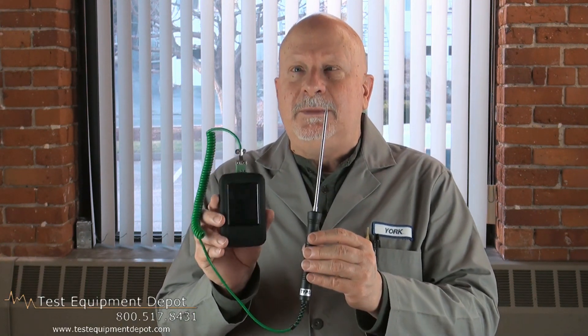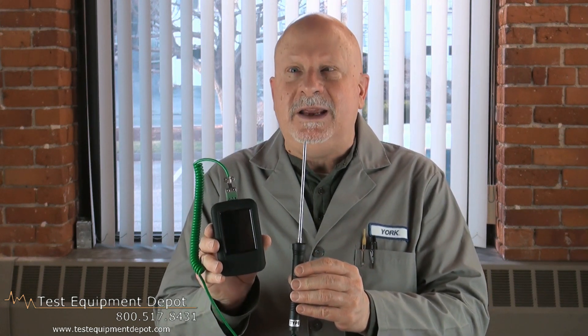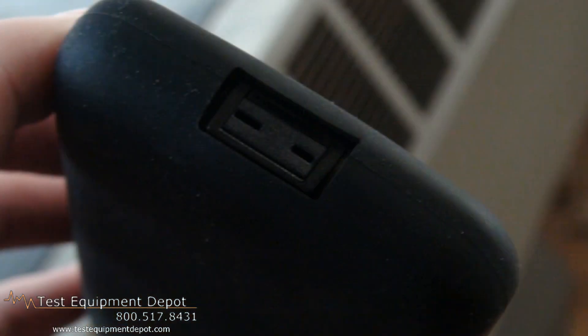Hi, everyone. I am York, the Service Department Manager here at Test Equipment Depot, and I'm going to introduce to you the Lascar EL Enviropad TC. This is user-selectable Celsius or Fahrenheit.